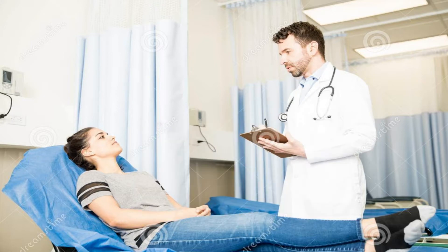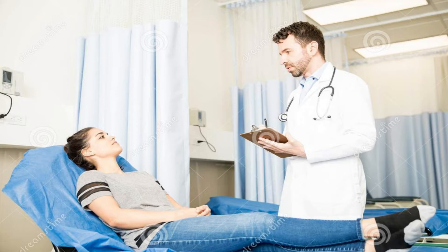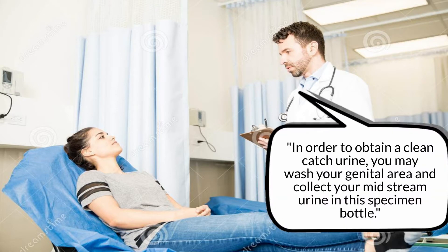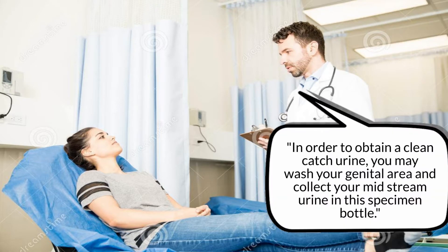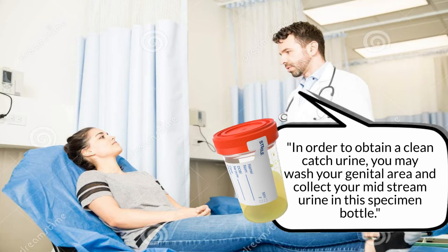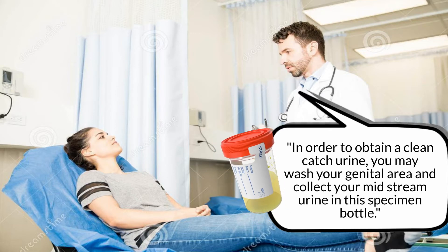The next step is to assist the patient to the bathroom and instruct her to collect a clean-catch or midstream urine into the specimen bottle by saying: 'In order to obtain a clean-catch urine, you may wash your genital area and collect your midstream urine in this specimen bottle.'